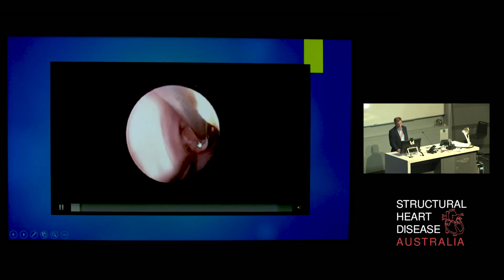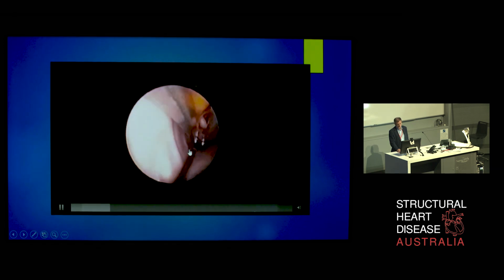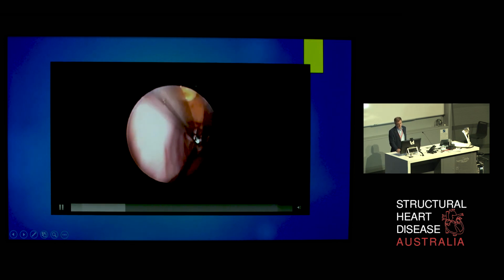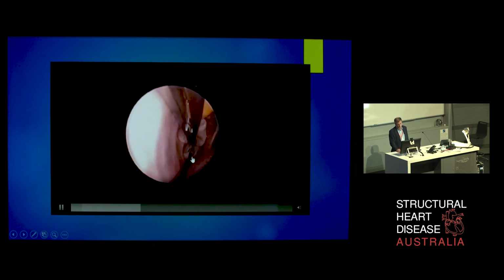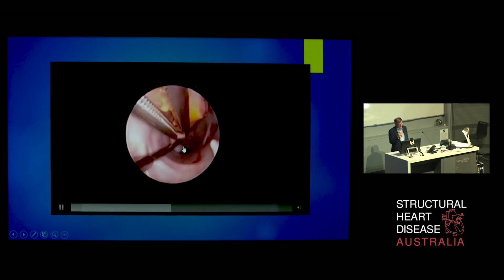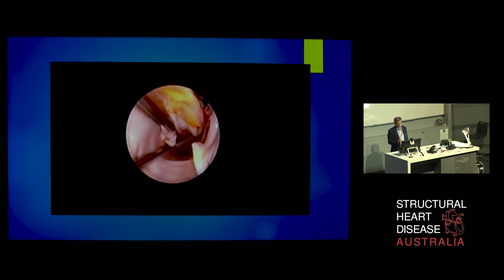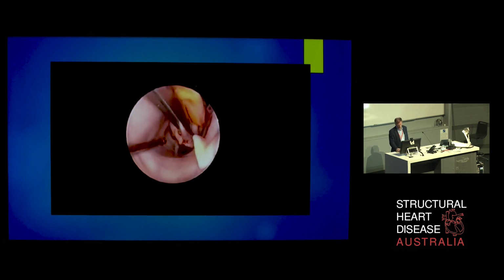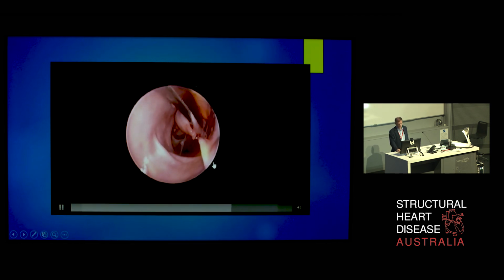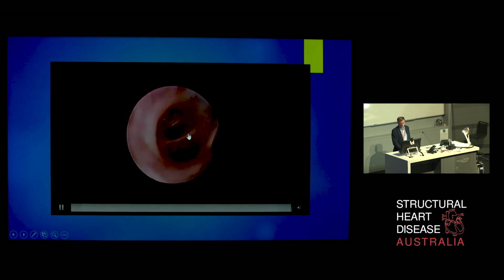And here's another example. This is a very fibrous pouch, and you can see all these tails that are going out into segmental branches. And you've got to chase them. You've got to know how hard to pull on them. If you pull too hard, then you snap it off. You've got to go chasing out some very small vessels. If you don't pull hard enough, it's not going to come. So it's a very experiential operation. It's a hard operation to teach. So here's a fibrous tail, and there it's gone. And there's a residual lesion.